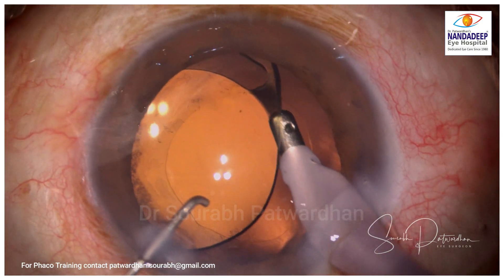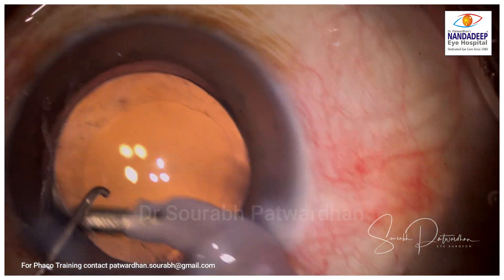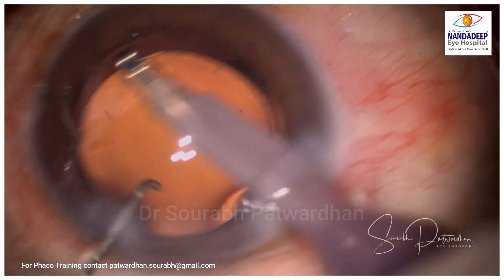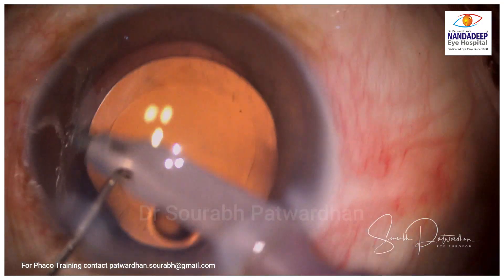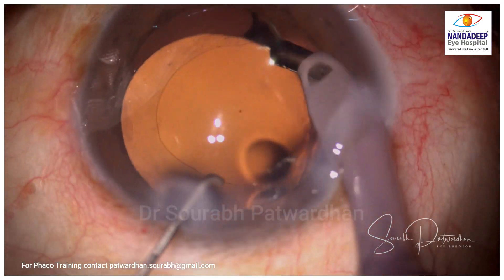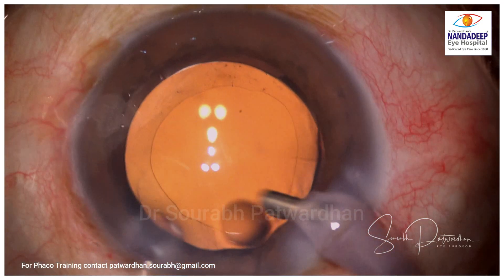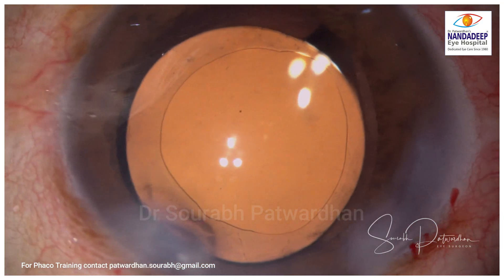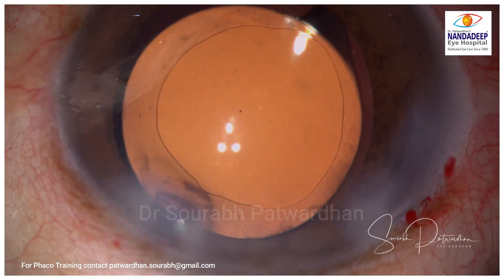You can then polish the anterior capsule again, because with retro-illumination you may see a few opacities there. How much you want to polish the anterior capsule is really variable — a few surgeons polish it extensively. Generally in my cases I don't tend to do extensive anterior capsular polishing apart from using the coaxial I&A. We can also use the bimanual I&A, which has much better reach to all parts; with coaxial I&A the sub-incisional area may be a little less polished.